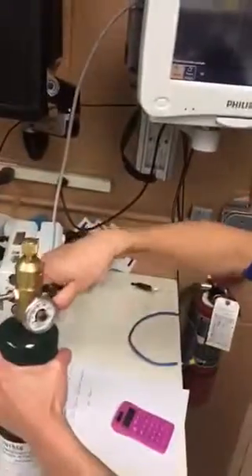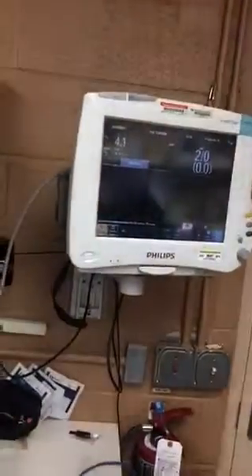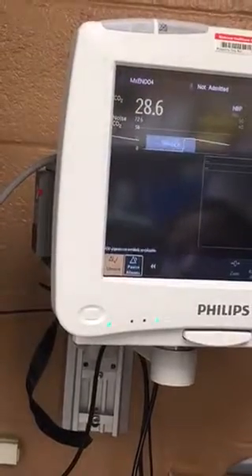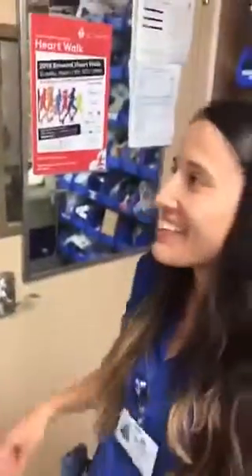To test that, or make sure it passed, we're going to do the reading again. So we're going to close it, we're going to open this gas again, and we should get a reading close to 38.2. Oh, my gas is over, I'm sorry. We couldn't test that. But yeah.